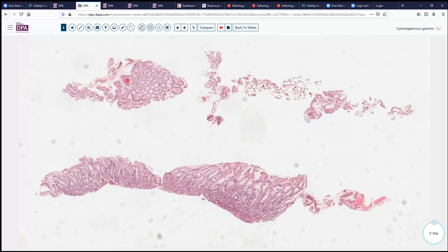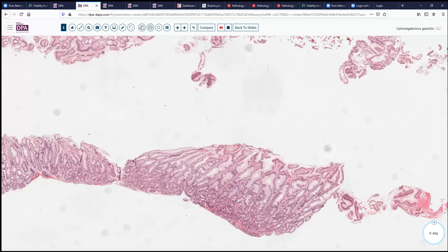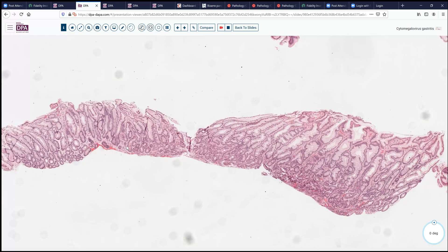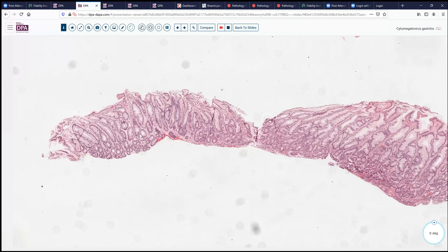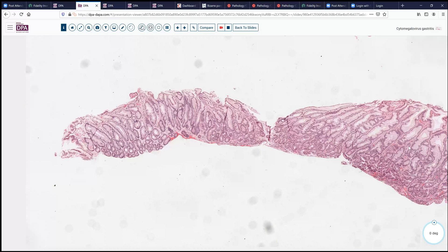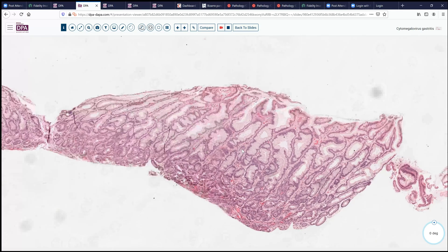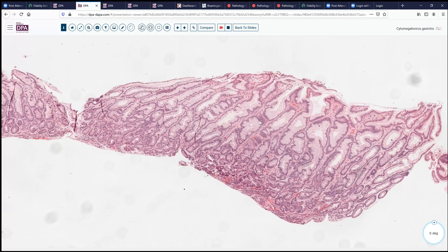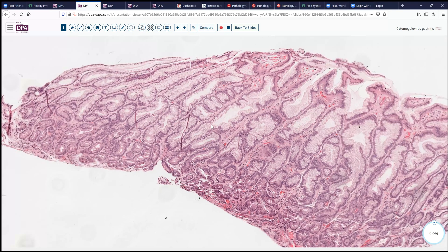As we look at this biopsy, we see fairly healthy looking stomach antrum here with a moderate degree of foveolar hyperplasia, maybe a little bit of corkscrewing. We don't see any ulceration at low magnification. We do see no evidence of intestinal metaplasia, and we don't have chronic inflammatory cells. Of course, this patient is a bone marrow transplant patient and may be somewhat immunocompromised, so we may not get a normal inflammatory response.